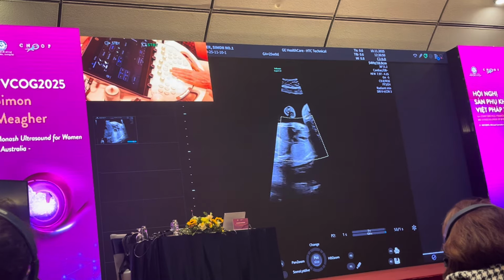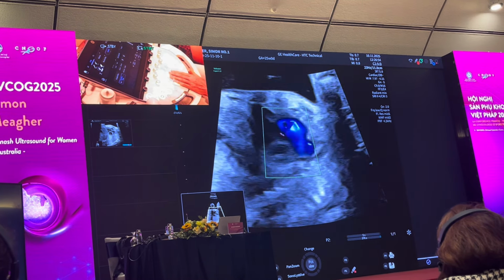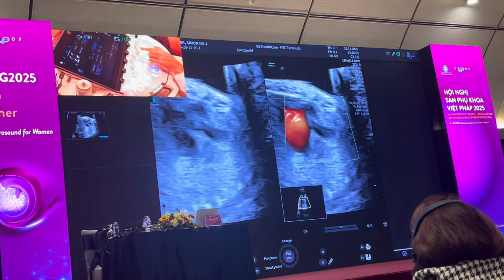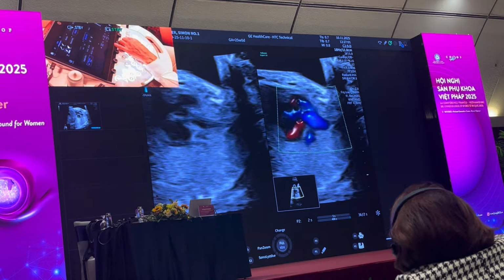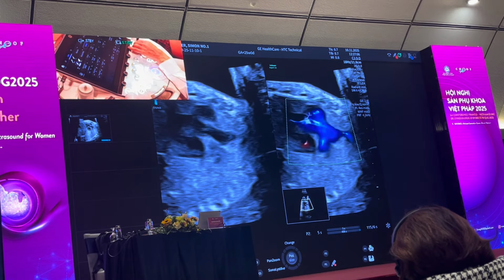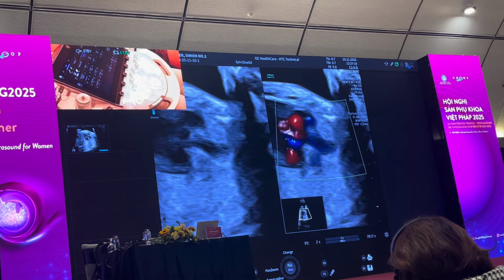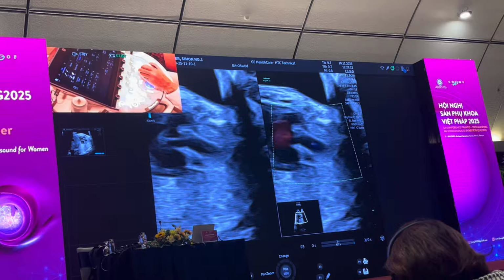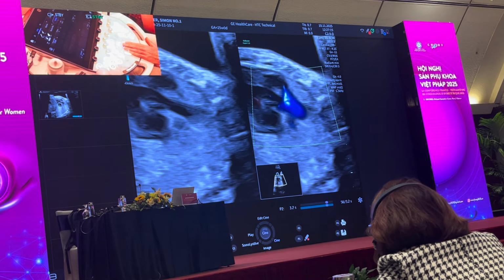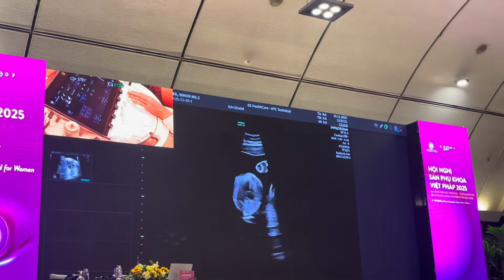It's also in this view, when looking at the left ventricular outflow tract, that you look to see that there's laminar flow in the aorta. When looking for laminar flow in the aorta, I split the image into 2D and color. I pull back on my gain, I increase my dynamic range, and just sharpen up the vessel coming out. If I'm seeing there's too much bleeding across the vessel wall, then I increase my PRF, and I pull back on my color gain, and I get tighter flow of the aorta coming out of that ventricle. So that's that particular outflow tract, okay?